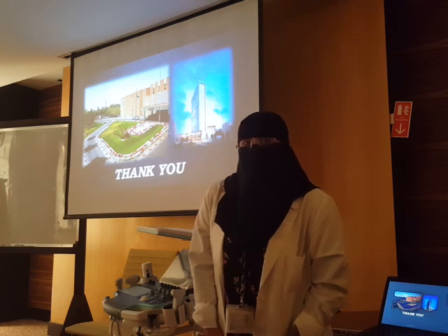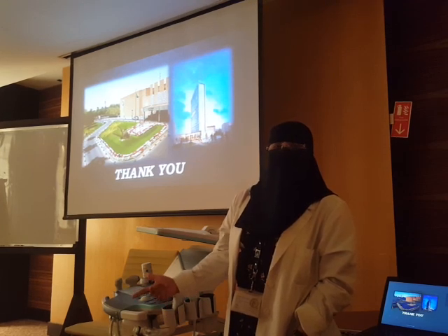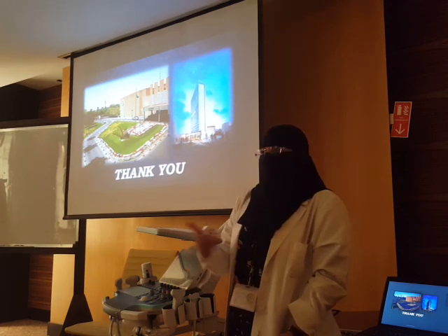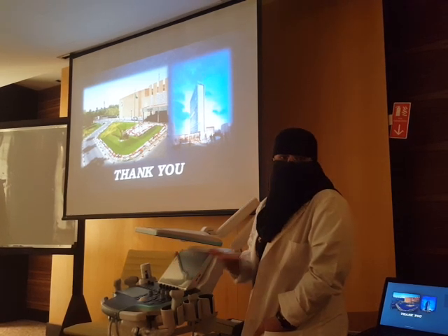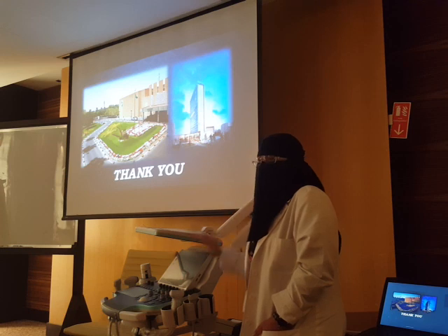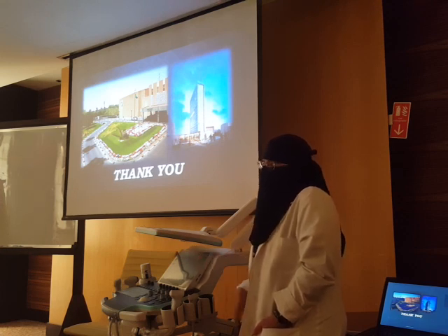Limitation للباول ultrasound في الانفانت، يعني اللي يخليها difficult أو صعبة, only the body habitus and the patient, if he's screaming and cannot calm down. The solution, if they cannot go for another technique, is to sedate the patient. Sometimes the patient cannot go for CT, as I mentioned before, because of the contrast, and we have to scan the patient. If the patient is very loud, screaming, and cannot stay still, we give the option of sedation to do a proper technique.